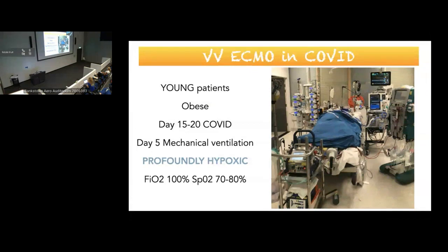they're so young. So we start rehabilitating them early on ECMO. We wean the paralysis as soon as possible. Now, that's not always possible in the first few days, but we try to get it off quickly. We wean the sedation as much as possible, and we try to get them awake enough so they can move around the bed, so they can start using some of their muscles, because there's nothing worse than having a patient on ECMO for 4 months that's basically paralysed from critical illness myopathy. And we normally percutaneous tracheostomy them early in the ECMO run.